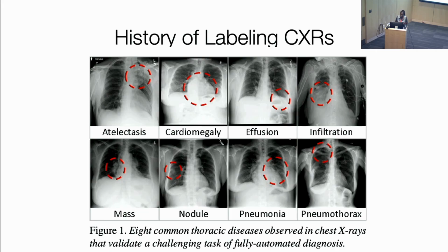And so what they were trying to show here is that if you could pair their chest x-ray images and their reports. And so this is the first thing, because radiologists are expensive. What people use to label reports are the radiology report, and I'll show you an example of that. And then to label what was normal, they would say, all these images don't have these 8 categories, so now I'm going to label it as normal, right? So it's like, if you're missing these 8 labels, then you're normal. But that's a big assumption, right? Because if you have a category that's not here, you could label an X-ray normal which is abnormal. Does that make sense? Okay.